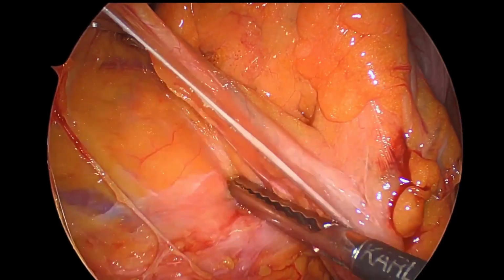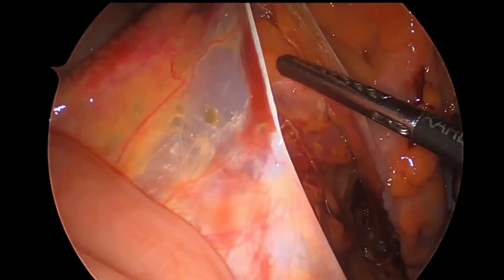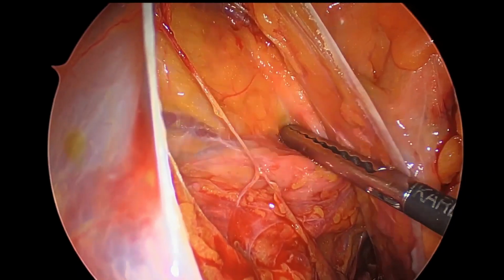That's the white line of Toldt that we're pushing down. You can see the difference and how that's not exposed. Another good tip for knowing that you've gone too deep is if you see the psoas muscle, you've gone too deep.